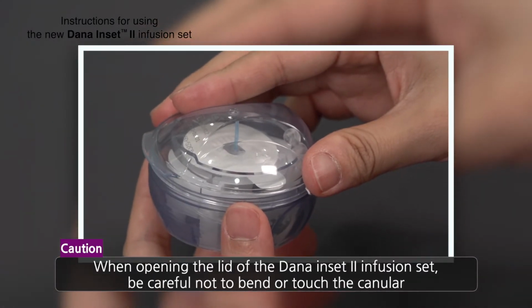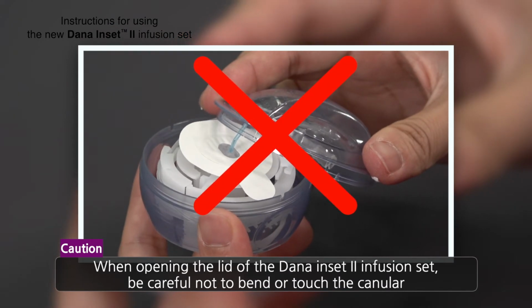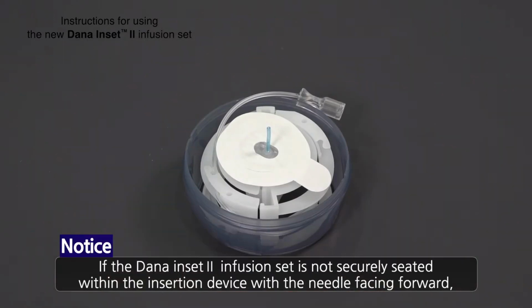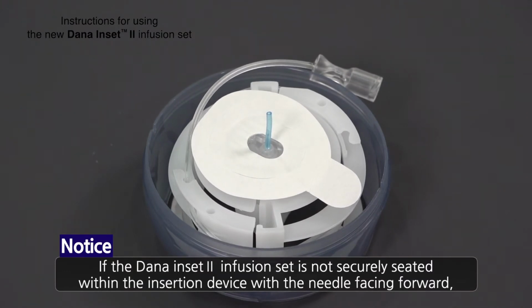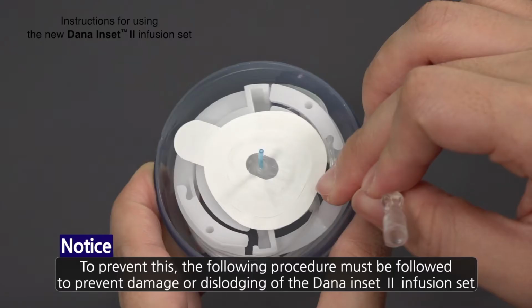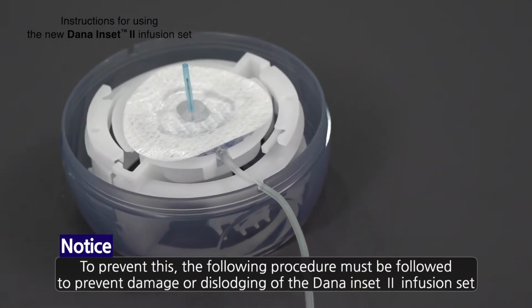Caution: when opening the lid of the Dana Inset II infusion set, be careful not to bend, touch, or damage the cannula. If the Dana Inset II infusion set is not securely seated within the insertion device with the cannula facing forward, pain or minor injury may occur. To prevent this, the following procedure must be followed to prevent damage or dislodging of the Dana Inset II infusion set.